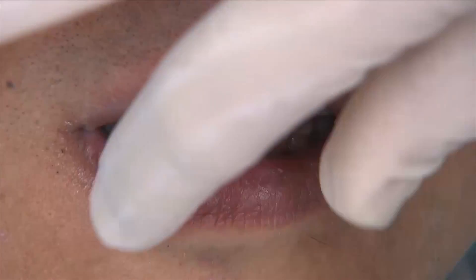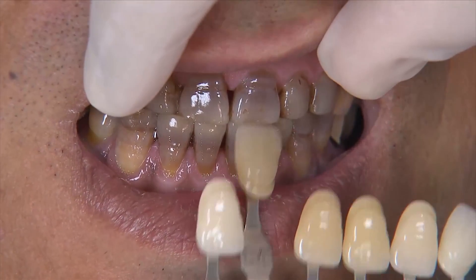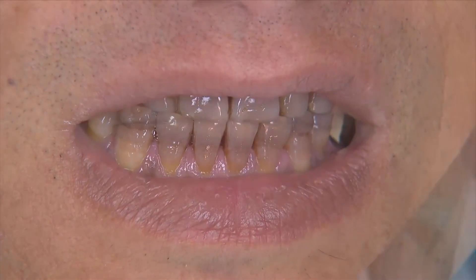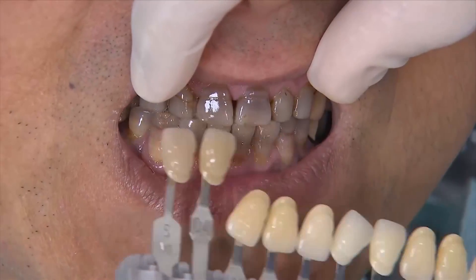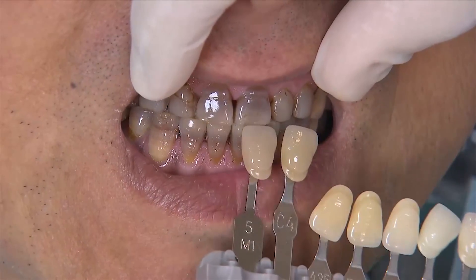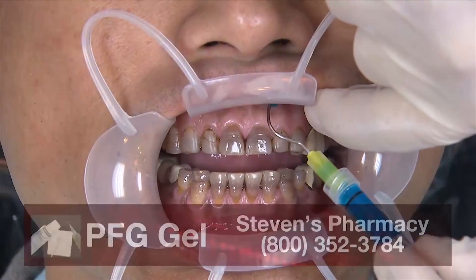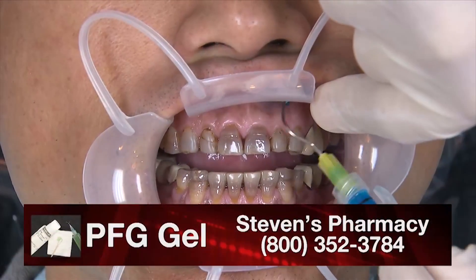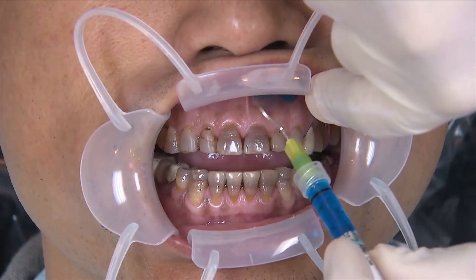We found a patient in the laboratory — actually a technician — who had some tetracycline staining. You can see it's pretty significant. He's got an edge-to-edge bite too, so that kind of calls for Bruxer if we're going to try to change that and get him away from the end-to-end. You can actually see the crossbite on tooth number six and seven, so we know he's a little rough on his teeth. You can see the dark shade he has.